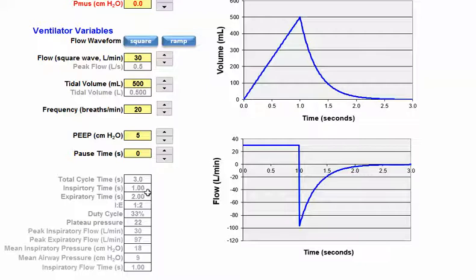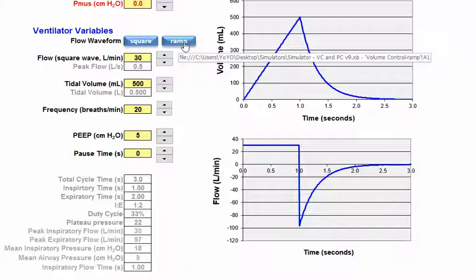And this is nice for students or users to realize how a decelerating flow affects my inspiratory time. Especially some ventilators just have a flow setting and a decelerating pattern, but you really don't know what the inspiratory time is because you're just setting your flow rate.